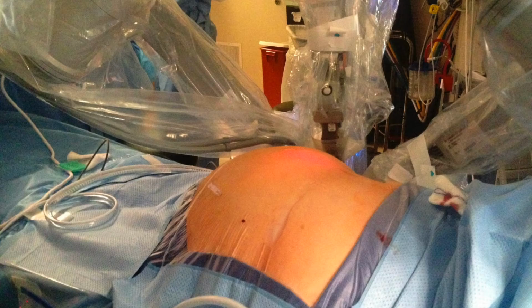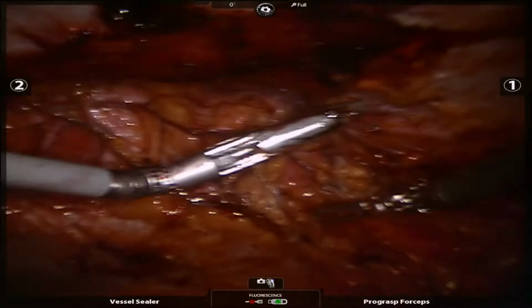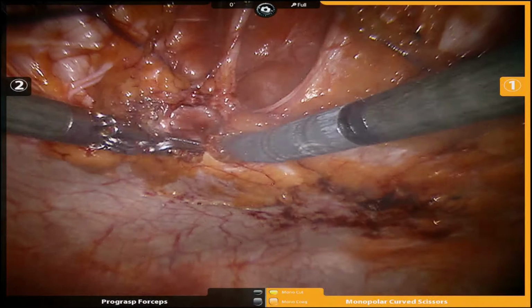Similar to conventional lap hernia repair, we begin with three trocars in the lateral abdomen. Following lysis of adhesions, the hernia defect is defined. The posterior sheath is incised and dissected off the rectus muscle.